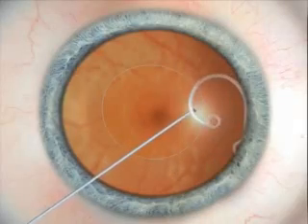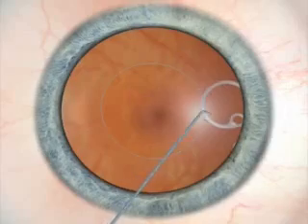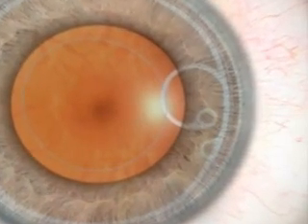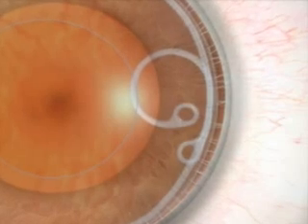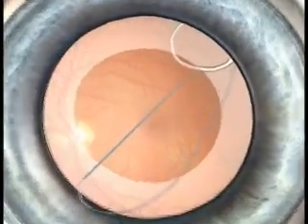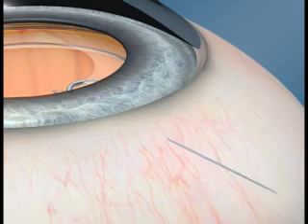The hook is used to reposition the fixation element on top of the anterior capsule. Both ends of the Malugin-modified Cionni capsular tension ring overlap each other in order to provide additional support to the capsular bag equator. The eyelet of the hook is used to secure the double-armed Prolene suture, which is then passed through the ciliary sulcus and scleral wall, achieving permanent fixation and stabilization of the capsular bag without violating its integrity.